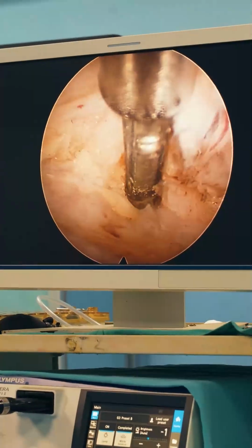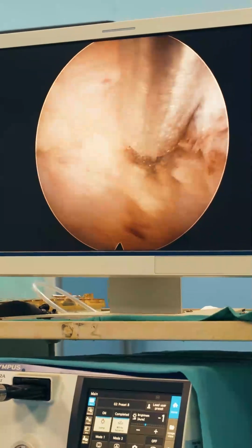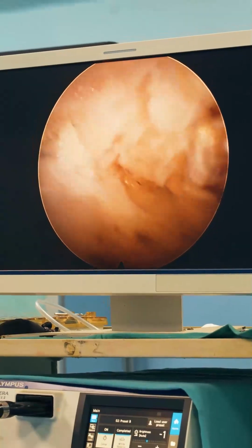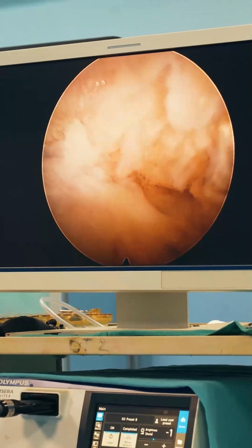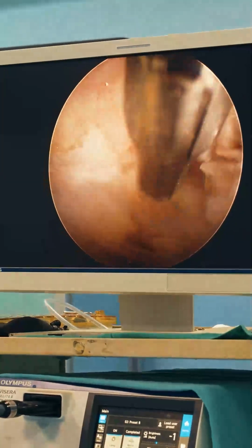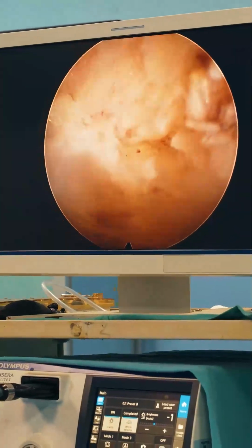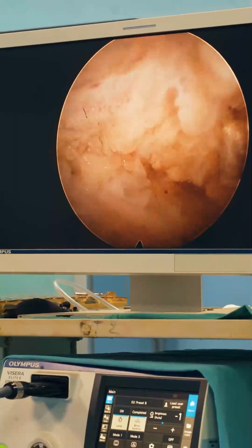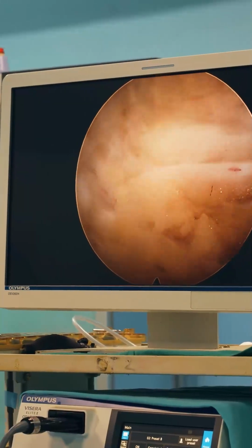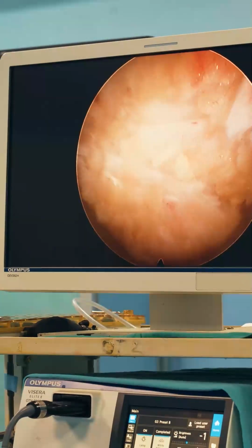So this is the inferior articular process. Here will be the joint. I will remove a little bit of soft tissue from this area so that you can see easily. Cut up. Okay. The anatomy is a little bit clear. We'll start drilling.